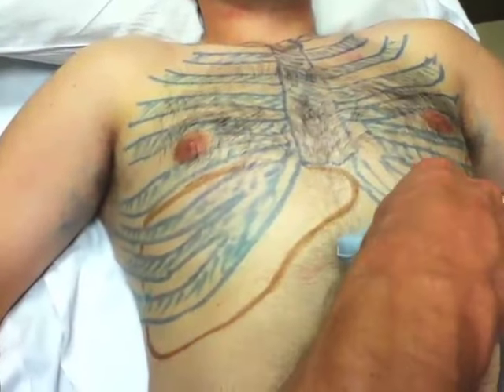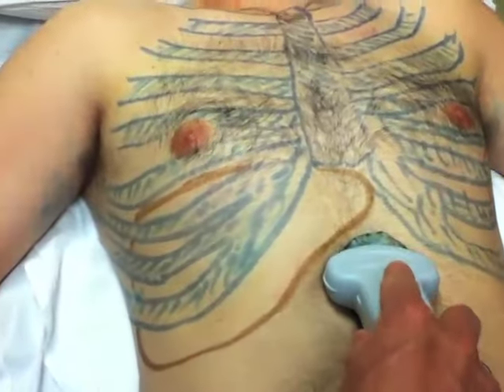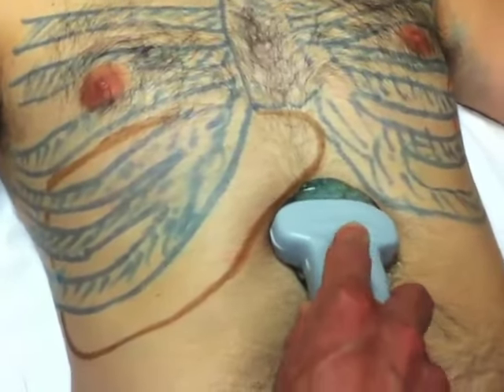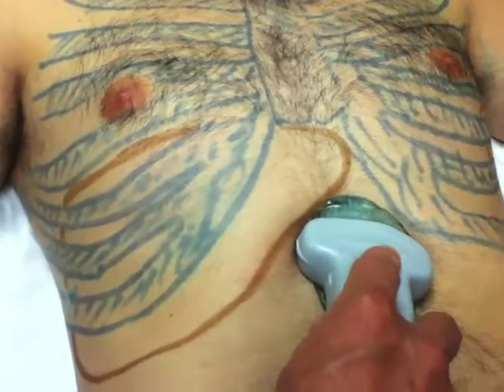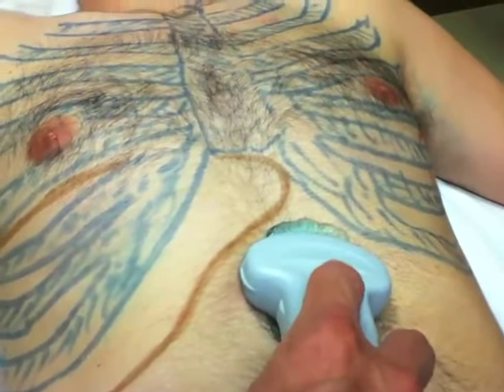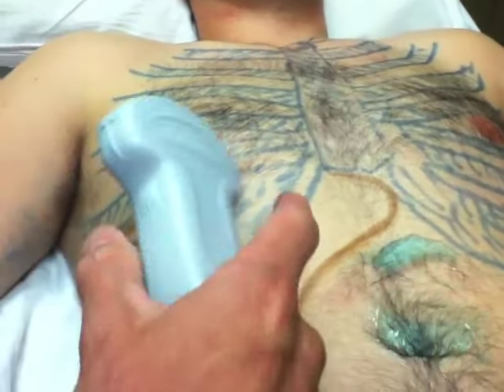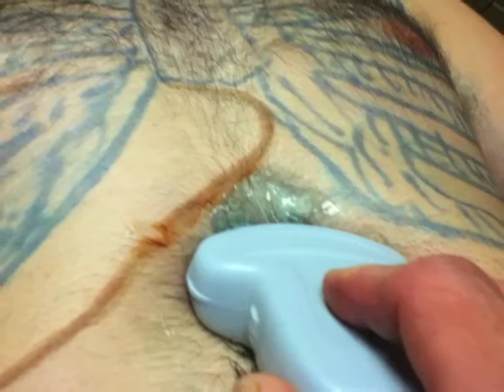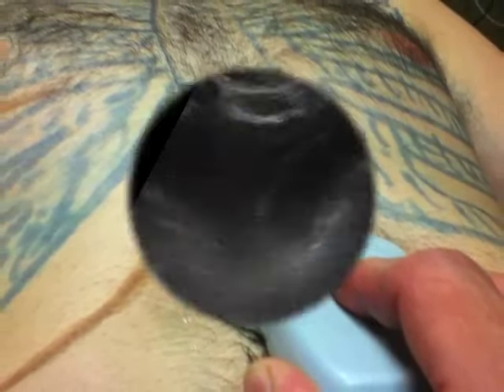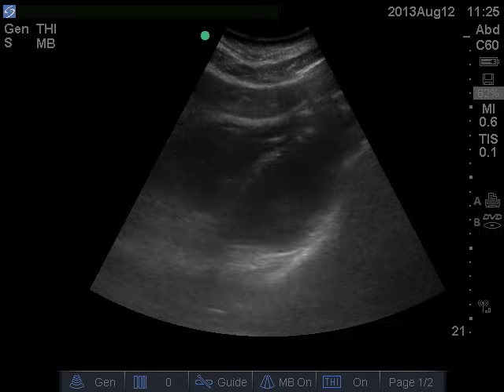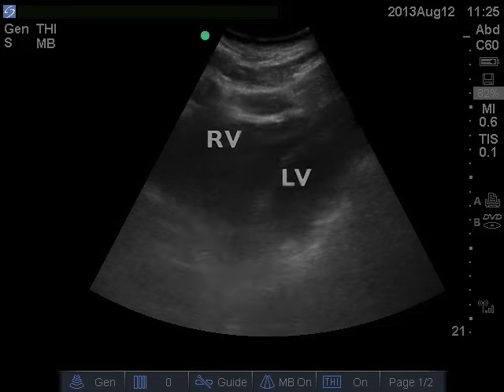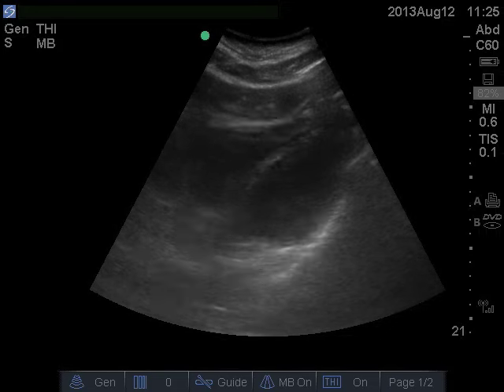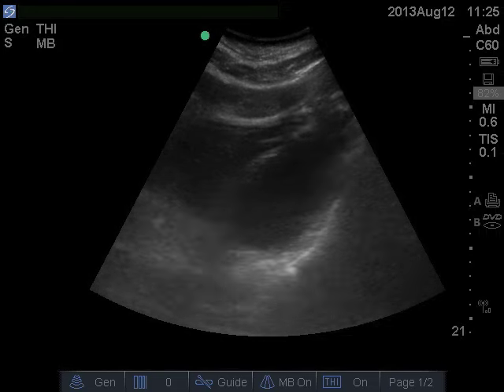For the heart, notice the different way of grabbing the probe. Place the probe just under the xiphoid process, quite flat, and push hard, angling a bit towards the heart. If you're having trouble seeing the heart, you can move the probe to the patient's right and use the liver as a window to see the heart. The most common mistake here is to have the probe too far inferior — stomach gas gets in the way. You will likely see two chambers of the heart: the crescent-shaped right ventricle and the more oval left ventricle.